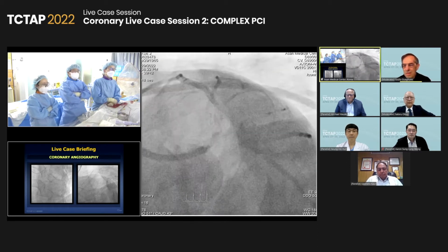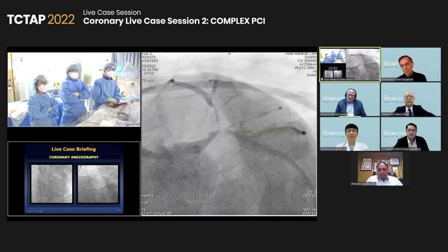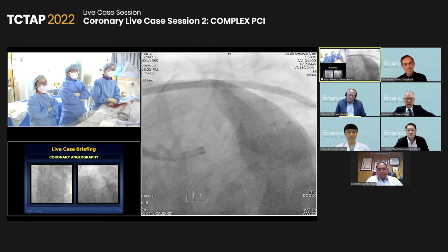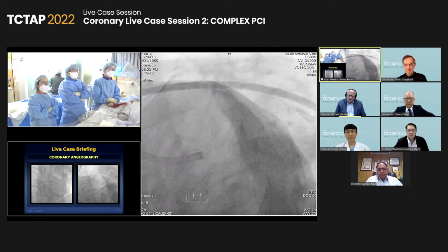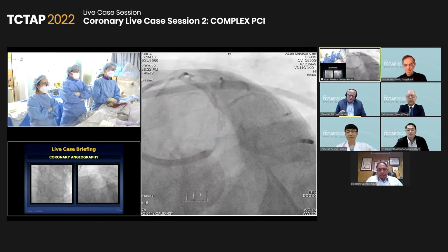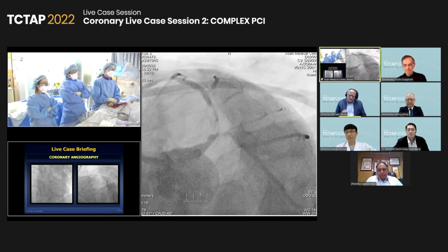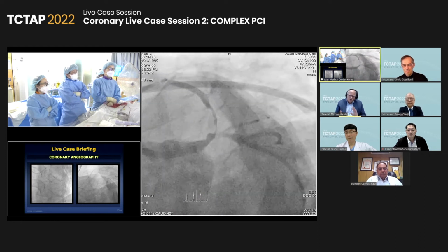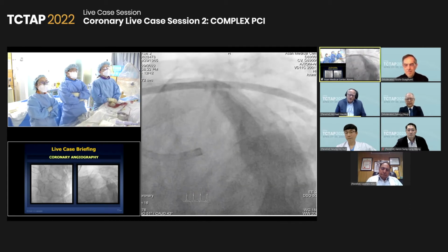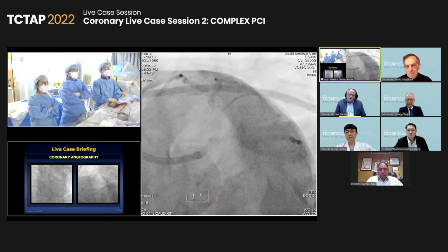Michael, do you agree on this strategy? I think this is a nice strategy. It's important to know how much calcium is there. I'm quite confident that we will come here along with a 2-stent strategy. The challenge is really the mismatch of the vessel size distal to the left main, because you see the left main looks to be a 5.0 vessel, something like that, and the distal vessels are around 3 angiographically at least. So you need to find the right match here. Yes, I think IVUS is, at least I would do IVUS again, is important.